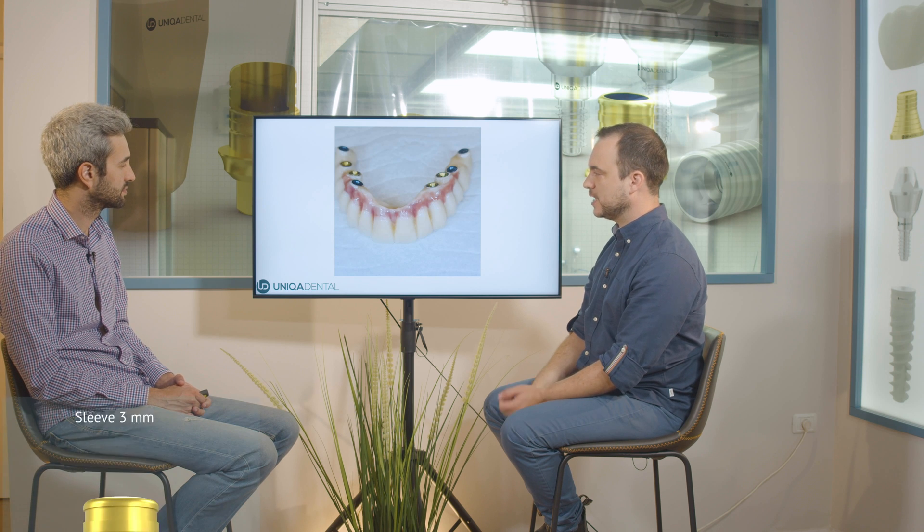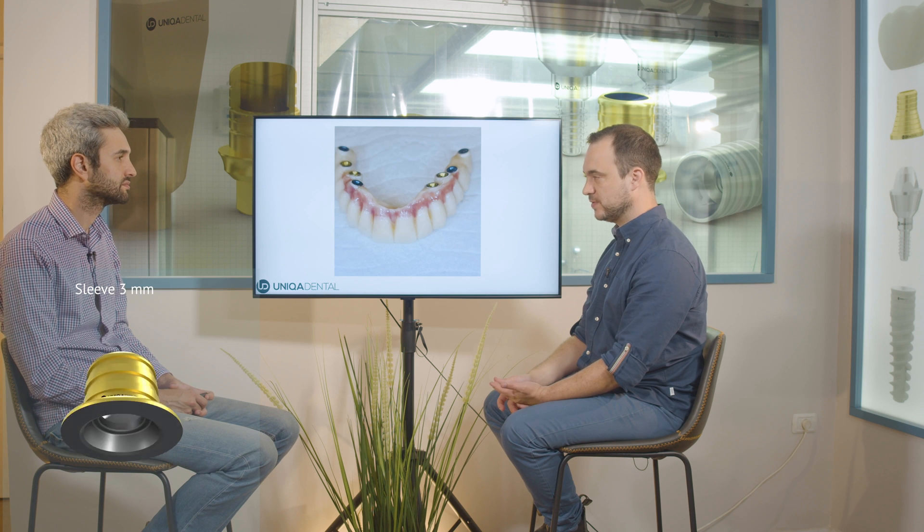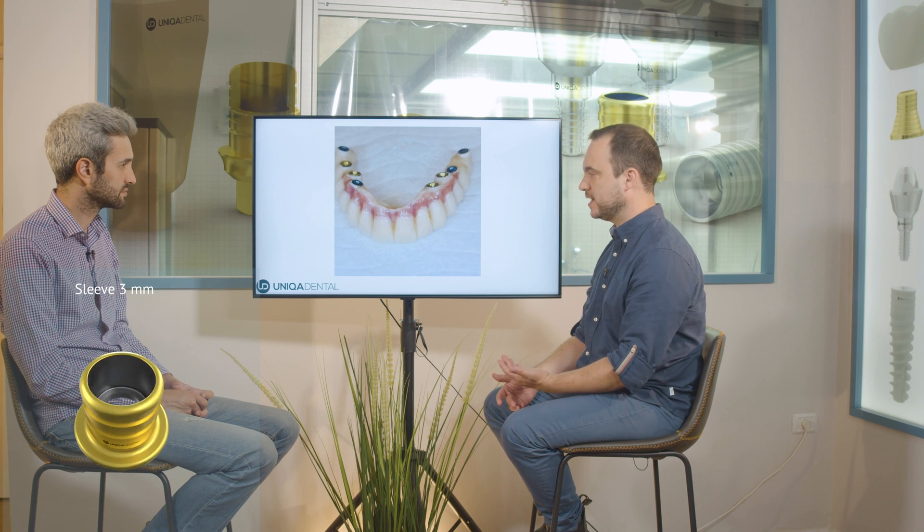We used the same protocol: cement the first anterior sleeves, then cement all the others in segments. The same approach was used for the lower bridge. Then we take out the bridge, polish all the cement residues — we want the zirconia to be clean. One of the biggest benefits of this approach is no cement residue remaining. You take out the bridge immediately after cementation, clean all residues, close all gaps, make sure everything is perfect, then cement and connect the bridges.